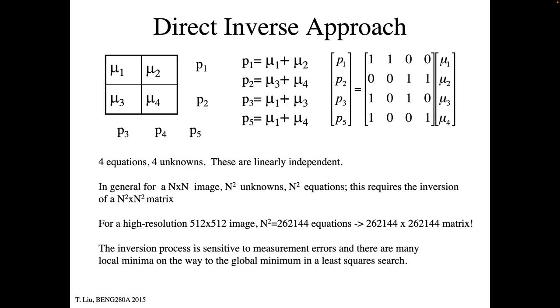Particularly if there is uncertainty or noise in the measurements. If these things have a little bit of jitter on them because you have noise, then trying to solve that matrix becomes a little rough. And so that's not really done. Perhaps as computers get bigger and bigger, going back to direct inversion to reconstruct these pictures might become in fashion.